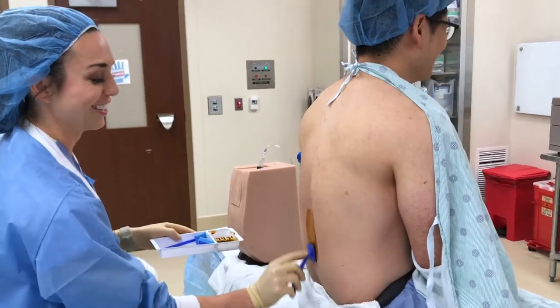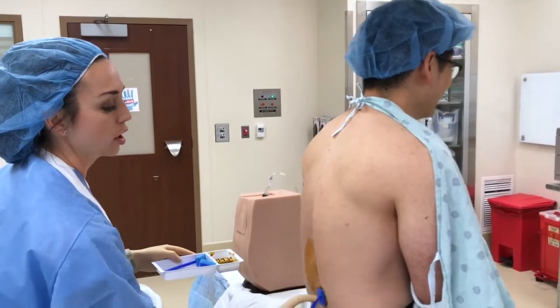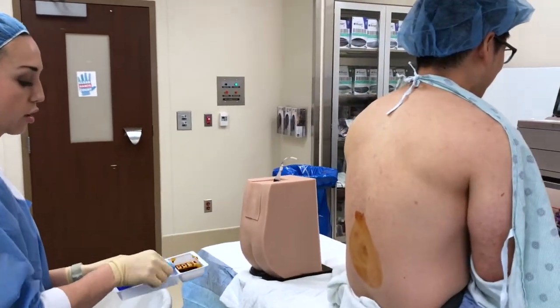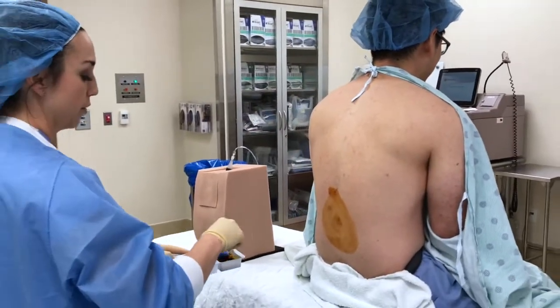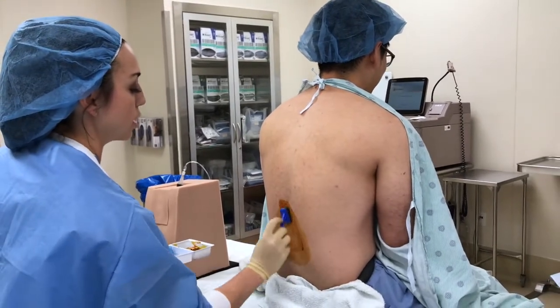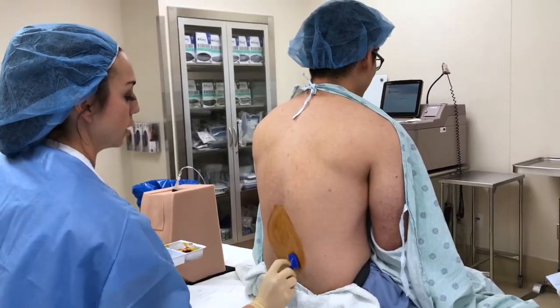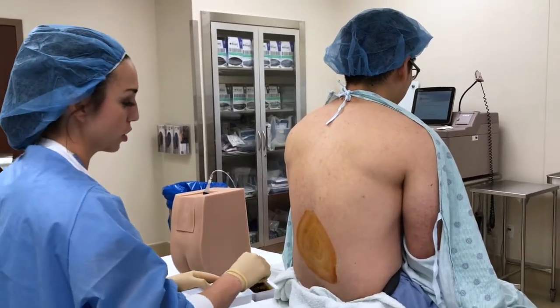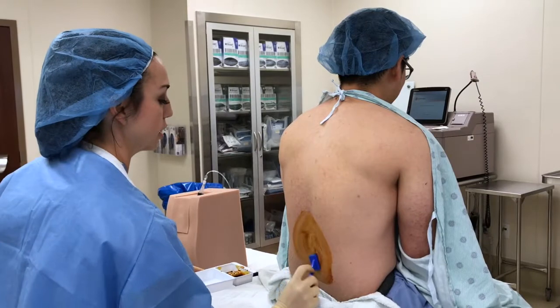Cold solution. I know, I'm sorry. And then again, circular motion from inside out near the area that we're going. All right, second cold solution, cold scratchy. And one more cold scratchy solution here. Cold scratchy.